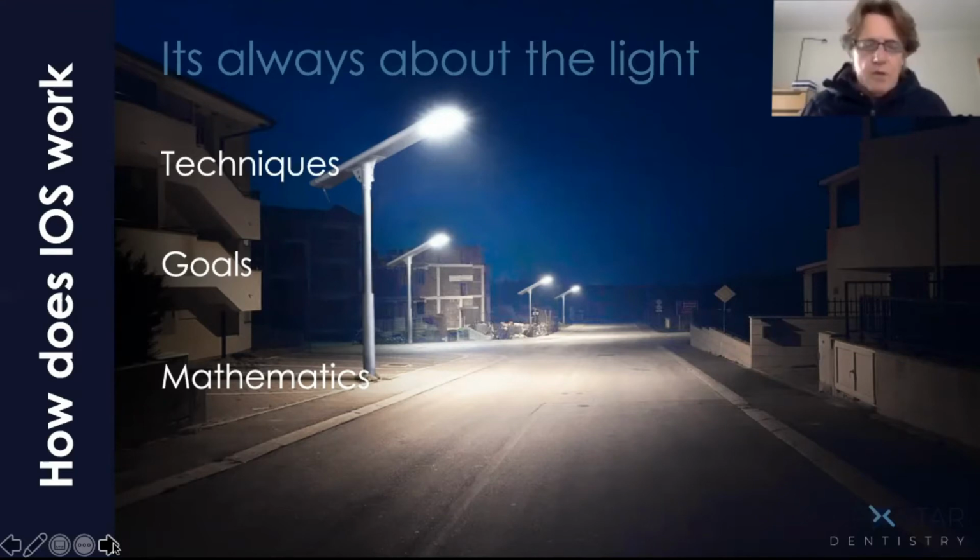If you take a polyvinyl siloxane impression, you probably get some material that's going to go into the crevice, and you'll find something that you can work with. But I can assure you, if the light is not going to reach into the interproximal box, you will have no information to design from, and you can't make a proper functional restoration.